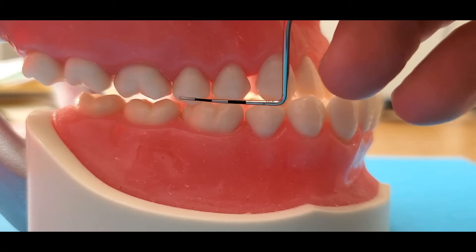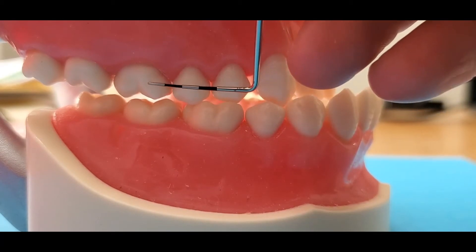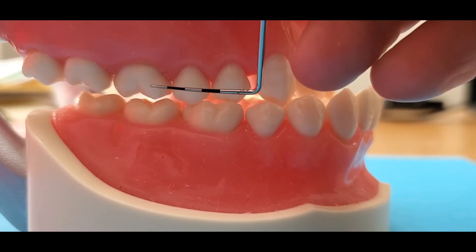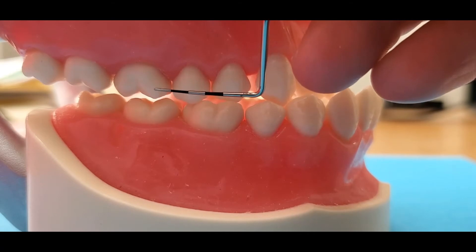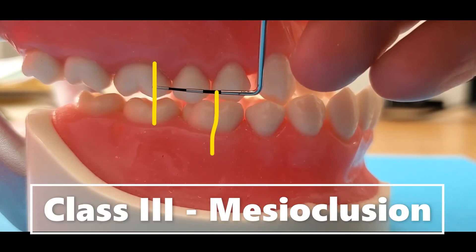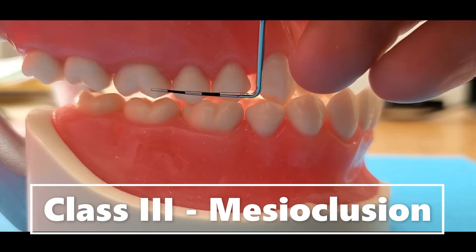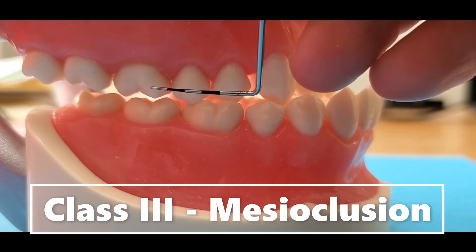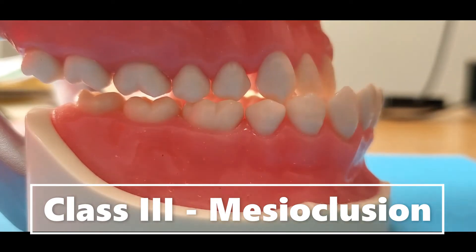Now I'm going to place my probe on the mesial buccal cusp and ask: am I at least 7mm from the mesial buccal cusp to the buccal groove of the mandibular molar? And I am. So this is a true class 3.